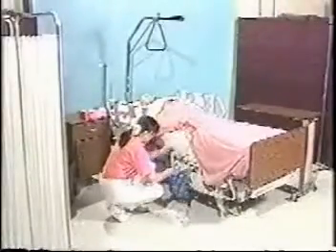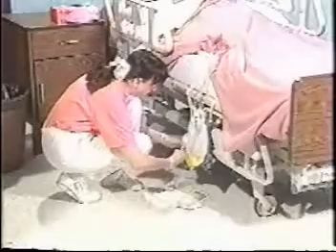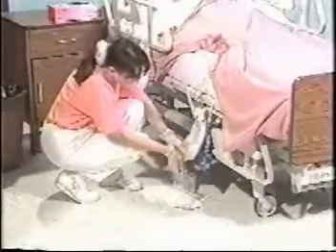Place the graduate on the paper towel under the drain spout. Do not kneel on the floor when doing this procedure. Remove the drainage bag from the bag cover. Remove the drain spout, being careful not to touch the tip of the spout itself, as germs can enter. Drain the urine into the graduate without letting the spout touch the sides of the graduate or anything else.